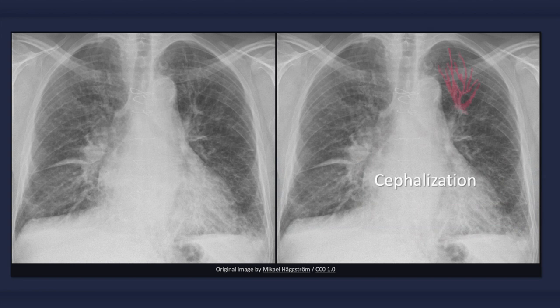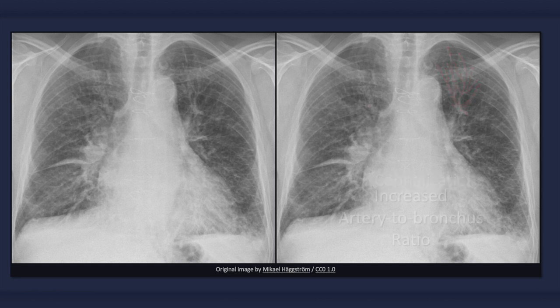Vascular redistribution is one of the first signs of congestive heart failure. Increased blood flow to pulmonary vessels in the upper lung zones results in an increase in size relative to blood vessels in the lower lung zones. This caudal-to-cranial redistribution of blood flow should only be inspected for in an erect x-ray, since equalization of blood flow may occur in the supine position. One way it can be identified is by the discovery of a superior lobe artery with a greater diameter than its accompanying bronchus.